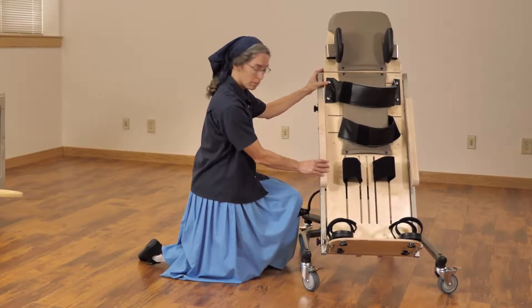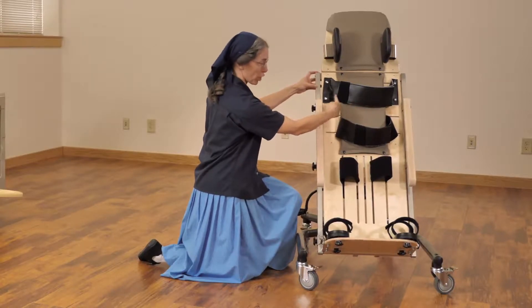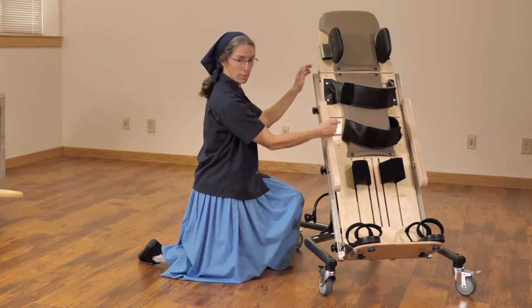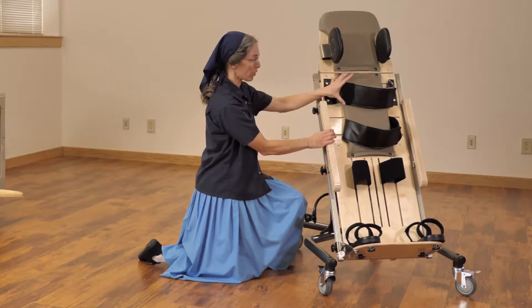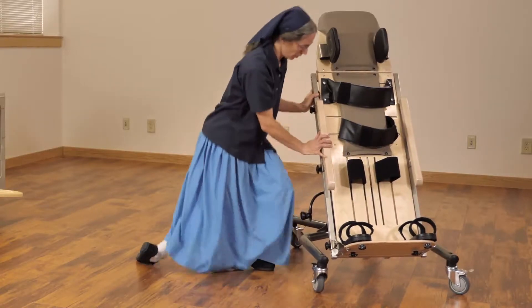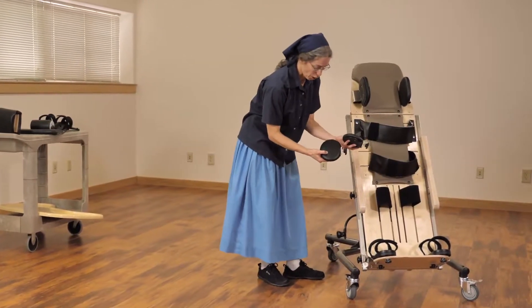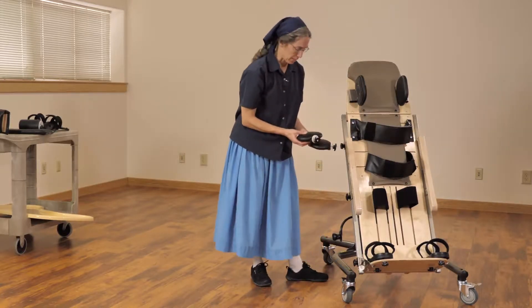On the small supine stander, the slots are horizontal, so you'll want to think carefully about your positioning for the trunk. On the large supine stander, they are vertical, allowing for more infinite positioning and the possibility of putting a lateral on the same level as the strap. We do offer a lateral — it is a more oval shape with a single knob, which can be used as trunk support as needed with the small supine stander.